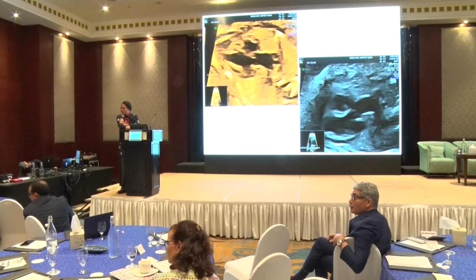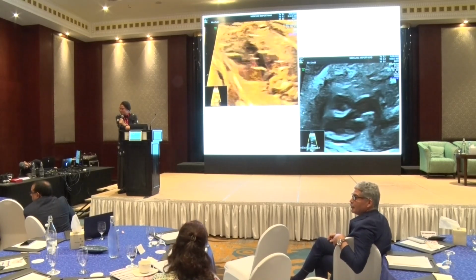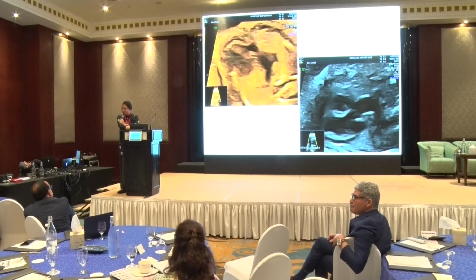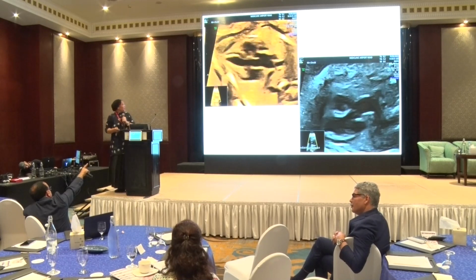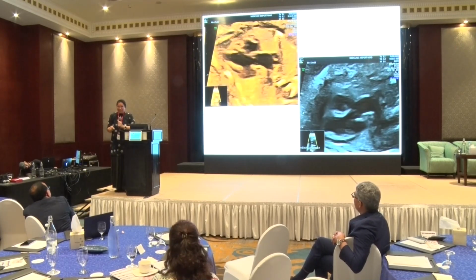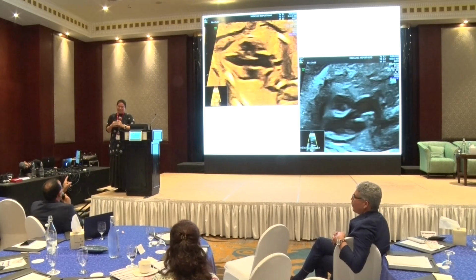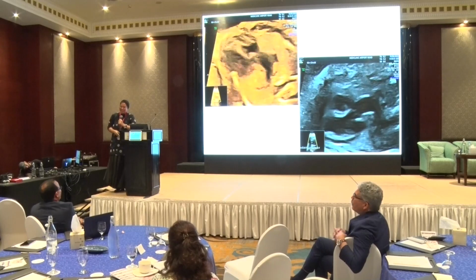Yes. Now looking at this image here, I agree with you. There is, more anteriorly, another one. I will call her again and try to see if there is a valve. No, you bring her and we scan together for 3 days. Okay, we'll do that.